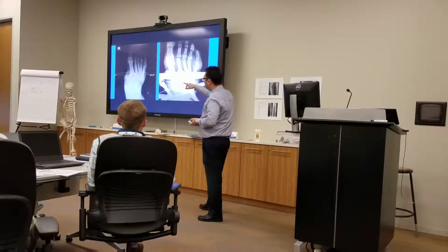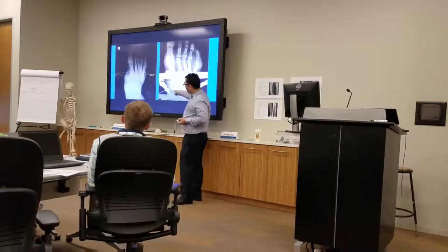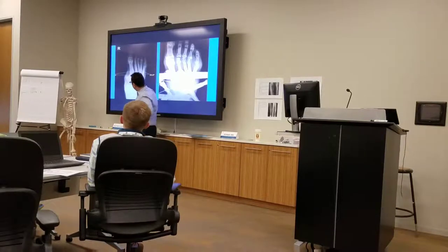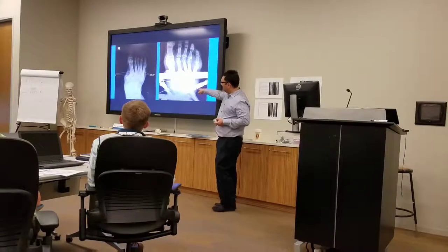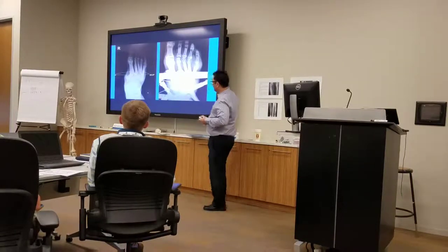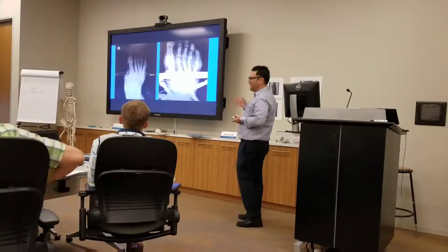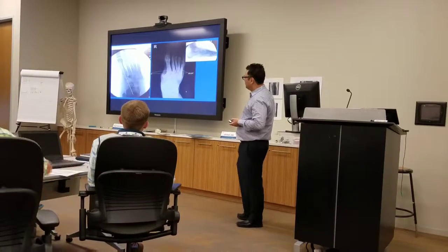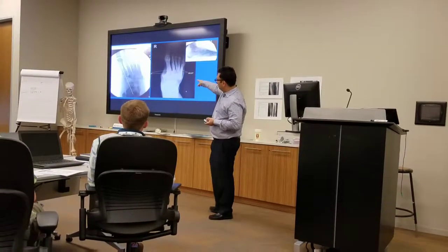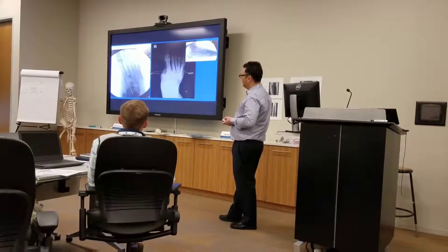So here's the original x-ray. And here you can see that we made our osteotomy kind of right through here. And I grew myself out a new navicular, the patient's own navicular. So basically we put into the program the abduction, the osteotomy, cut the bone, and grew out this new bone. Look carefully: on the right is the old x-ray, and the new one on the left is with his new bone over there, fully corrected foot.